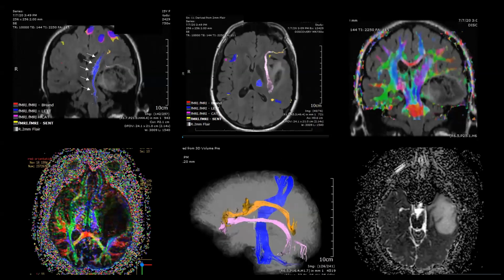Got it? Okay. Oh, that's a DTI. That's a DTI, isn't it? Yeah. Okay, here we go. T2 FLAIR mismatch sign. So what I was looking for is astrocytoma, IDH mutant. That is absolutely correct as a diagnosis. Now you might say, how do you know it's not an anaplastic astro? Because we don't use that term anymore for IDH mutant disease. It's astrocytoma for every grade, including 4. Astrocytoma, IDH mutant, grade 2, grade 3, grade 4. Do you like that? Oh, yeah.